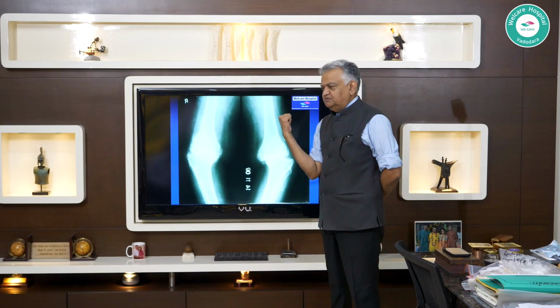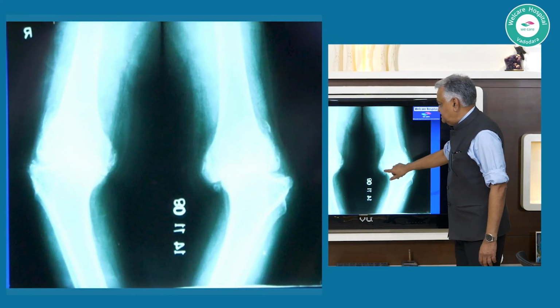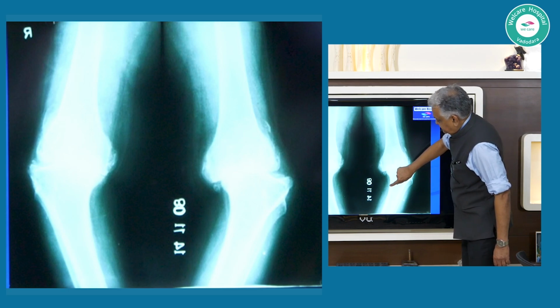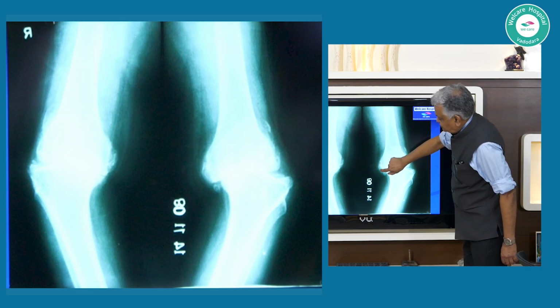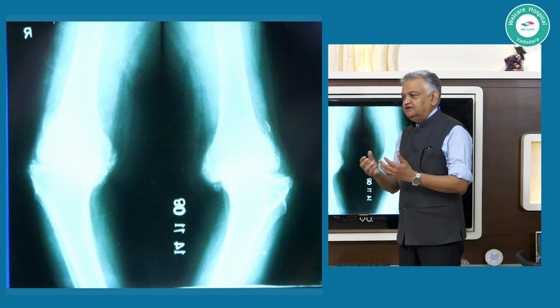Shiv Prasad, do you have a comment? Remove the medial osteophyte, this built up. So this itself, see, here is your MCL soft tissue shadow, and then it goes like this and like that here. Now you remove this osteophyte and that itself will decompress, so you start getting some leeway in your MCL, right?